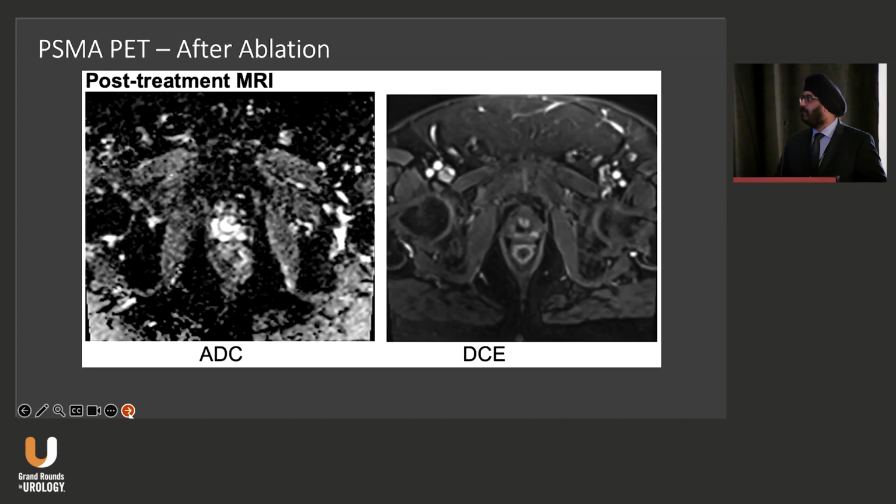So post-therapy, MRI is good for post-therapy prostate imaging, but it cannot replace biopsy. Even if the MRI is negative, we all biopsy our patients, right? And this has actually been proven. So this was an ablation patient. This patient basically had really high disease and ended up getting whole gland therapy at an institution because he just wanted it. He did not want anything else.